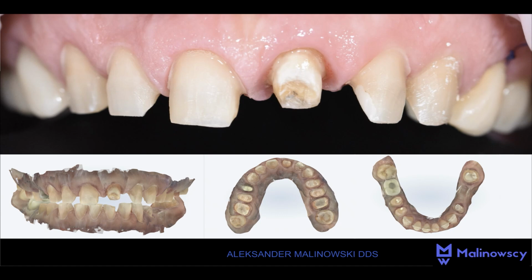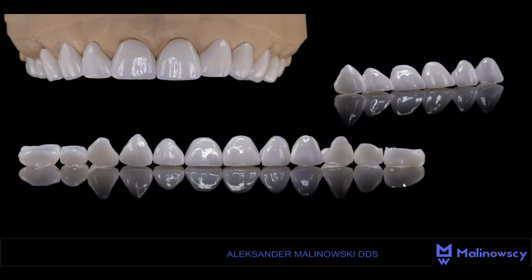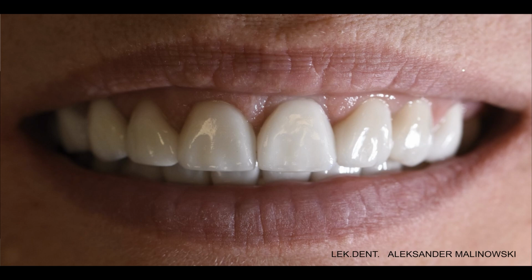Here we can see the preparation. Please let's compare the minimally invasive preparation, due to designing with the facial scanner, and the old preparation. Can anyone see the difference? Here you can see the intraoral scans also and photos of the work done by our beloved laboratory. We now see photos taken a few months after the prosthetic work was cemented.